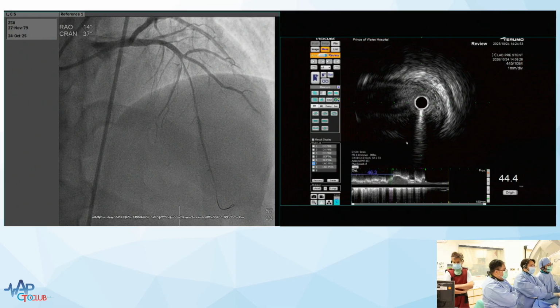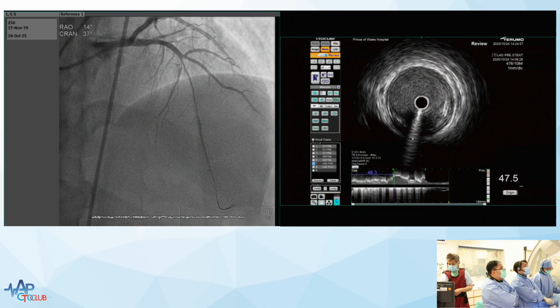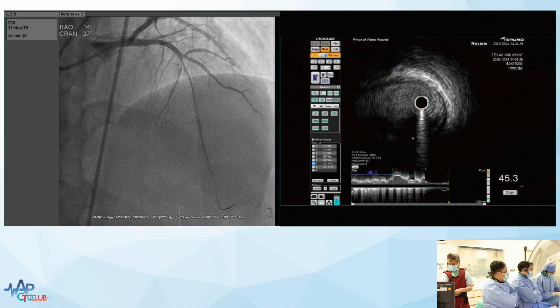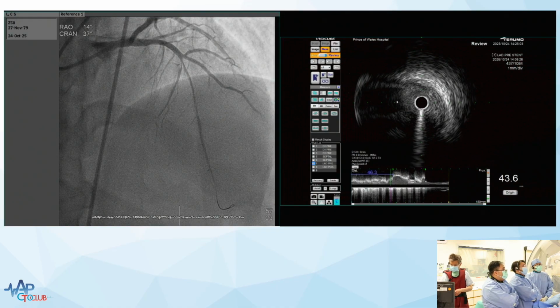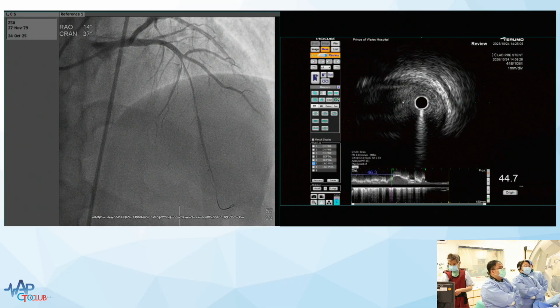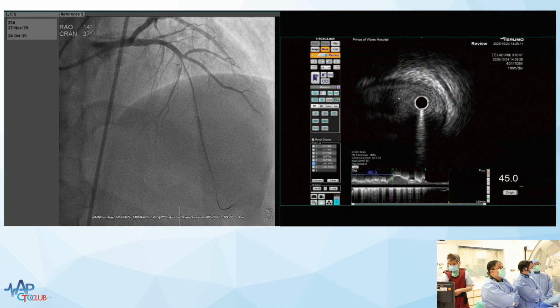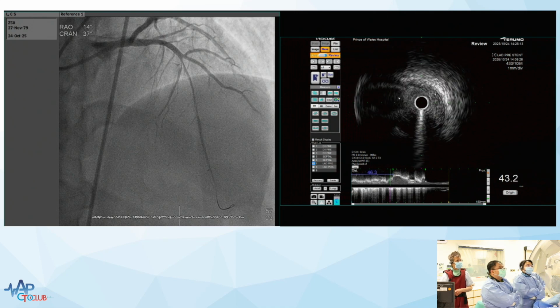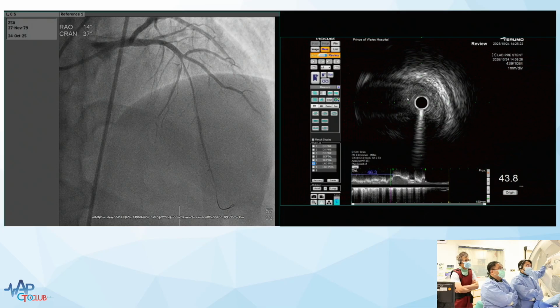And I don't think that anyone in the room would say that they were confident that there wasn't an issue at the origin of the diagonal. Maybe not. Look, this is proximal and it's okay. This may be just the shadowing. Maybe. I don't think there's much of a problem angiographically, and there's no flap. No, I don't see anything. And maybe this is just the blood dropout from the shadow of the carina. Could be. You see, OCT would be better.